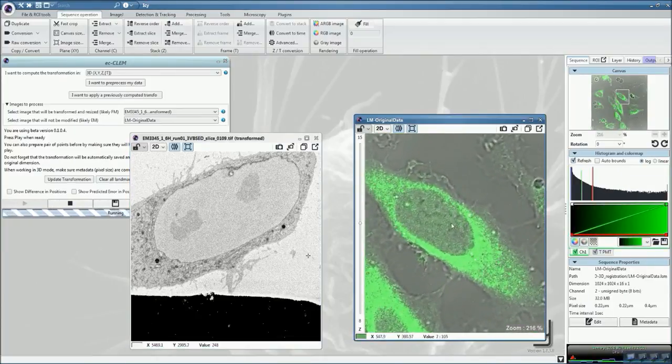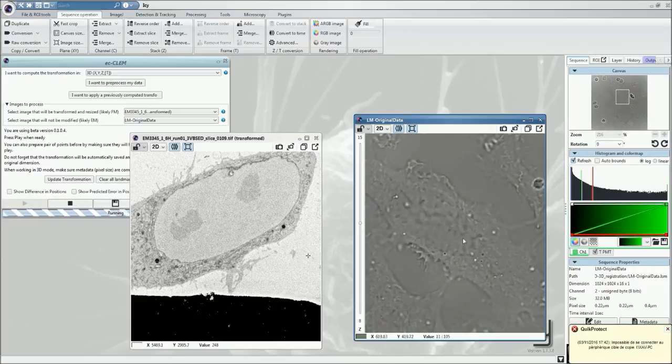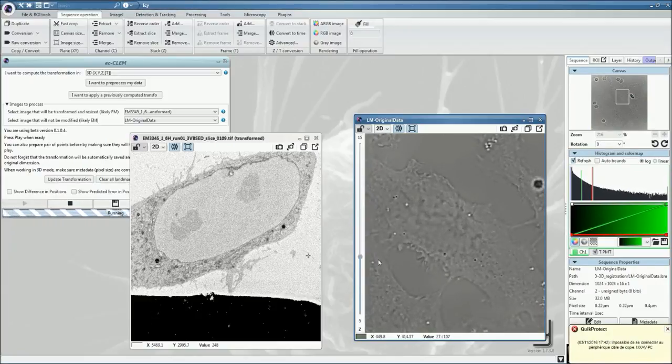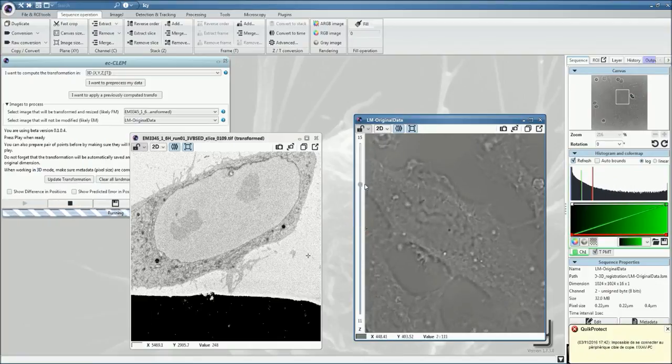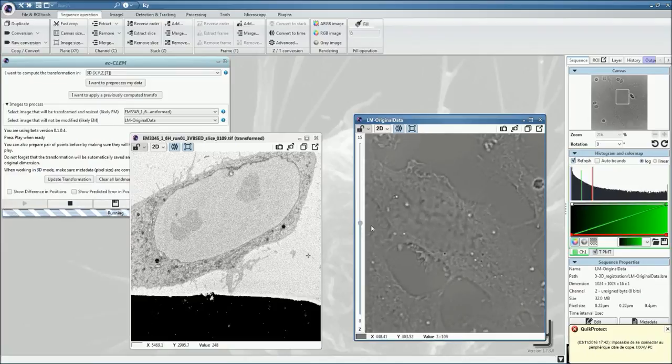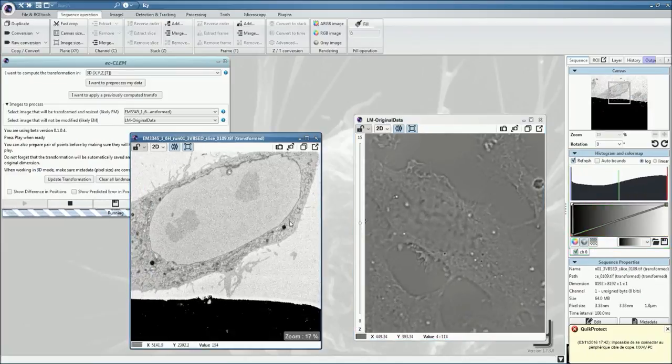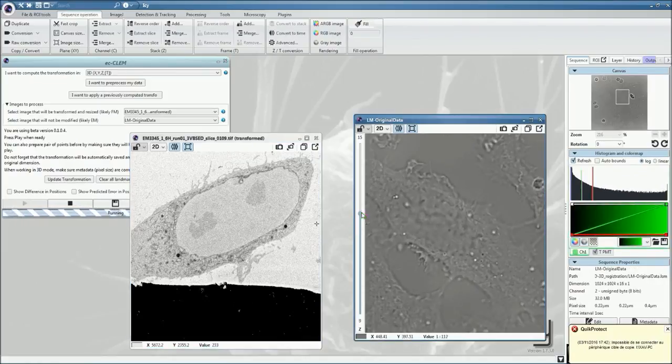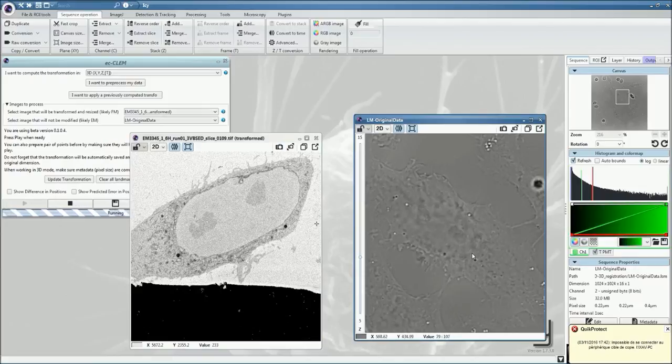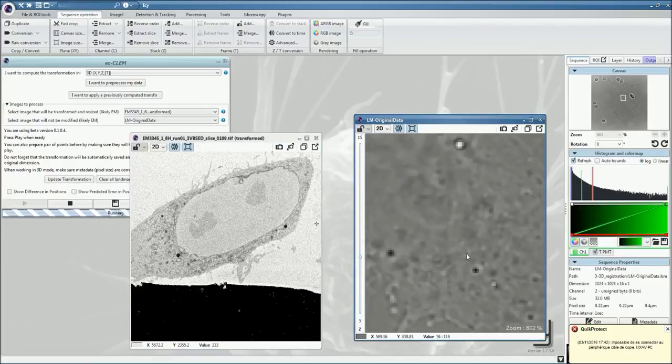In that case, when we're looking at this particular specimen, we're looking at this particular cell. When we switch off the fluorescence channel, we see that some of the dots which are appearing here, in black or white depending on the plane, correspond to those dots here in the cell. So we will use these guys to align properly our sections.